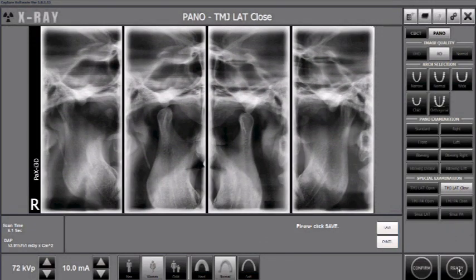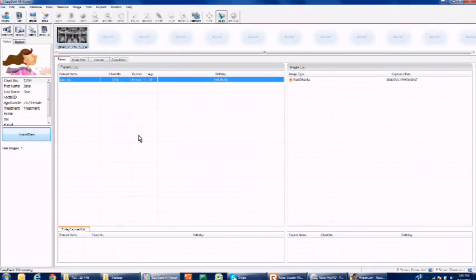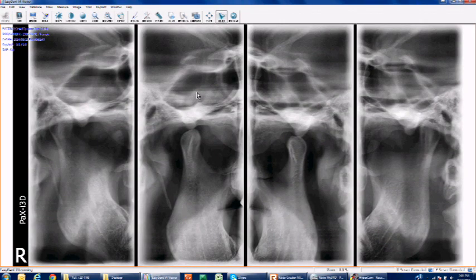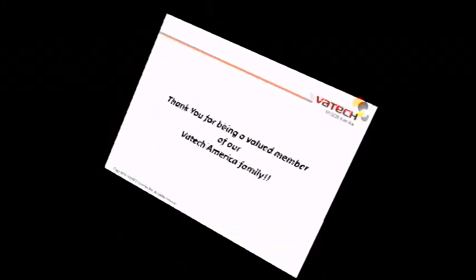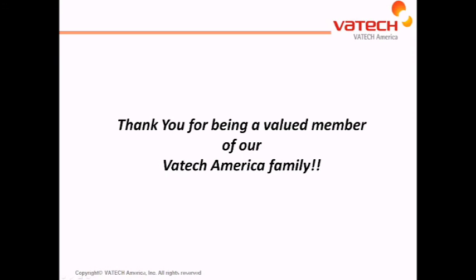After capturing the image with the mouth in a closed position and releasing the patient, navigate back to the capture software. Verify that you captured the desired image, then left-click Save. To verify the image is saved in the EZDent4 database, left-click the patient name under the patient list to refresh the database, navigate to the thumbnail view above, double-click, and view the image on your screen. This concludes our four-sectional view TMJ using the PaxEye panorama system. Thank you for your time, and thank you for being a valued member of the VATEC America family.